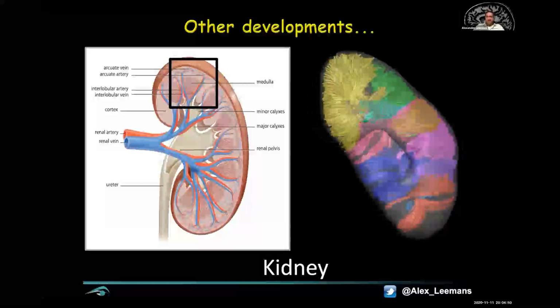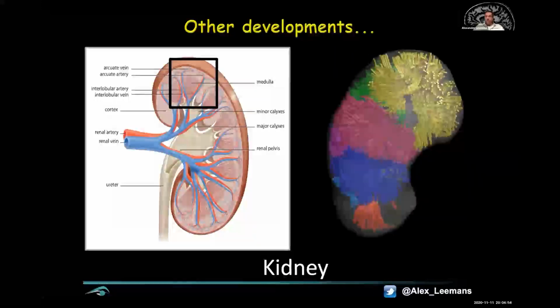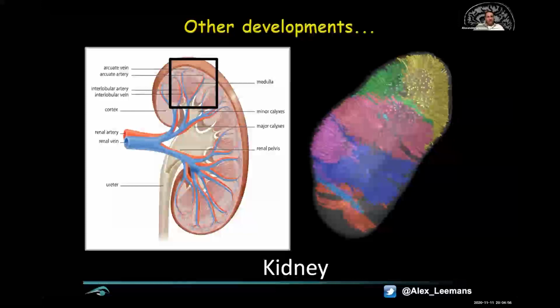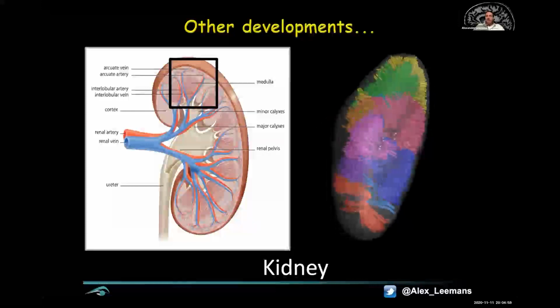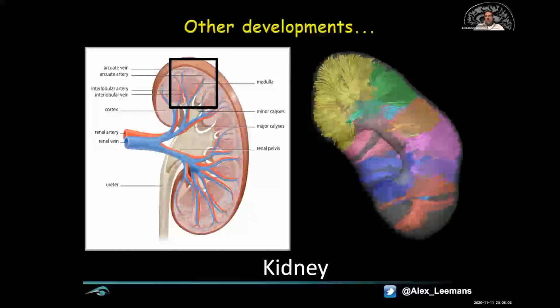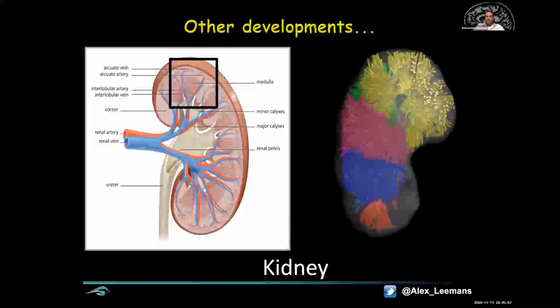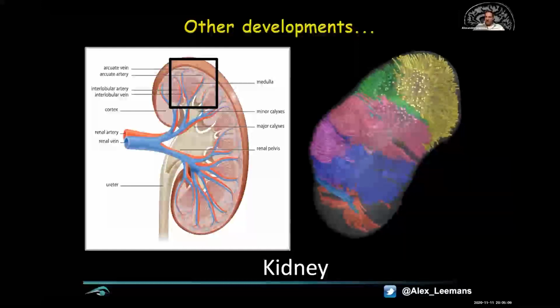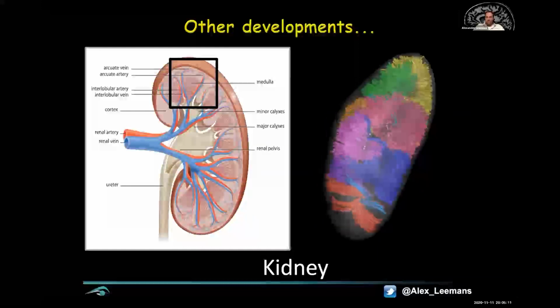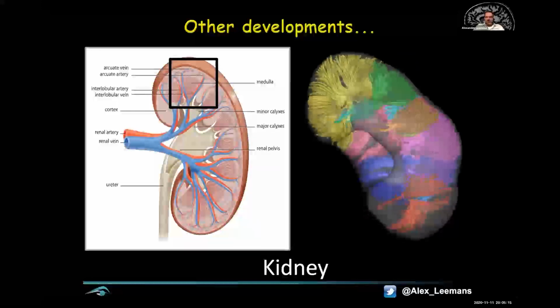So yeah, anything that has soft tissue and a lot of water molecules, we can start imaging. So we have looked at even the anal sphincter, the female pelvic floor, all the muscle tissue, the heart, but even beyond human tissue, you can look at squids. They've got very nice architecture there, the muscle, the neurons, the big neurons, etc. So there's a lot of opportunities to look at.